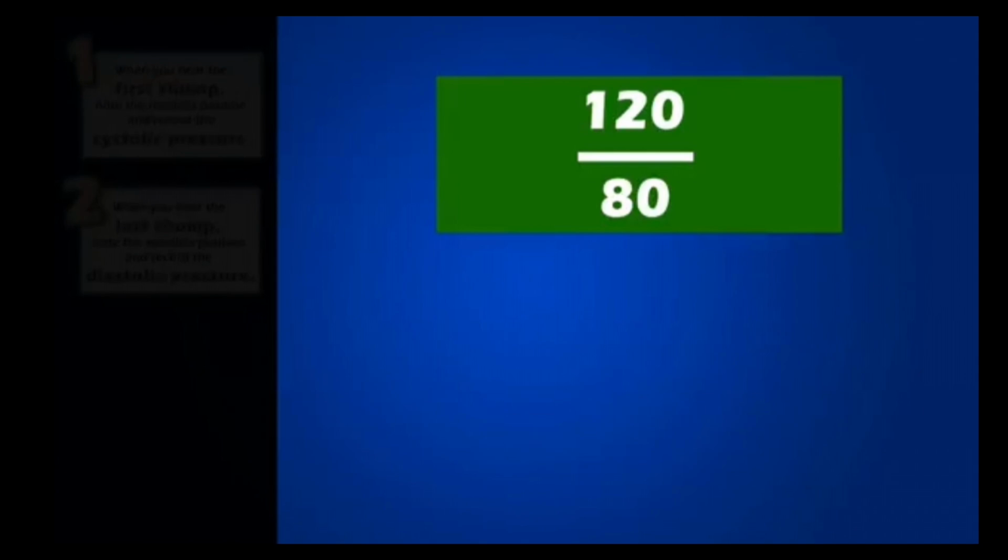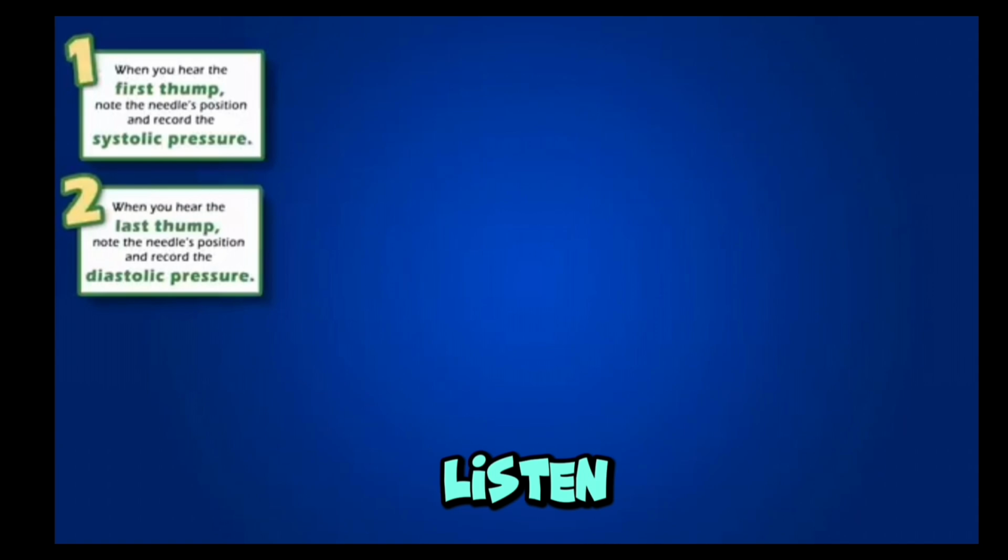Of course, matching the displayed answer is the goal. To achieve the most accurate answer, listen closely and write down your answers. I will reveal the correct answer once the simulation ends.